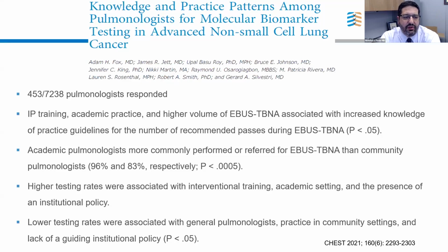Well, they found that folks that seem to focus more on lung cancer, like interventional pulmonologists, academic practice, that weren't having to master 100 different diseases, they were a little more focused, or ones that had higher volume of procedures, had an increased compliance with the guidelines for things like recommended passes. Academic pulmonologists would actually either perform or refer for EBUS more often versus just sending for a needle biopsy and then having to restage later.